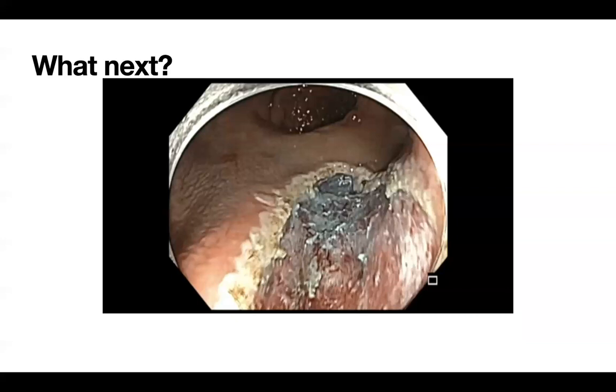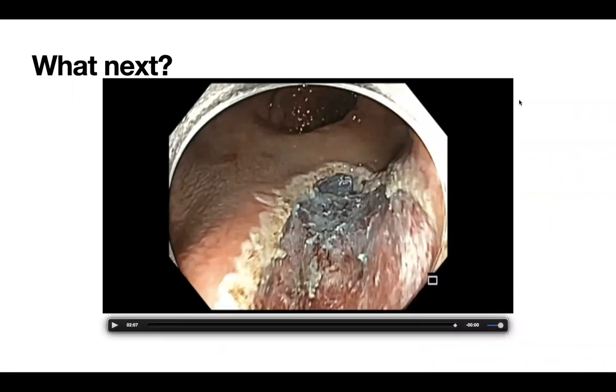I fully agree with you, Sriram. The only thing is when I was looking at this video, I said, I missed these 2 steps. I should have actually included them. No, that is what makes us human, right? It can happen to anybody and everybody. The reason I am appreciating you showing this video and making a point to talk about it is for every one of us to let ourselves know, and also for any trainees, to make sure that yes, if Dr. Raju can do it, you will do it. So you better be extra careful.